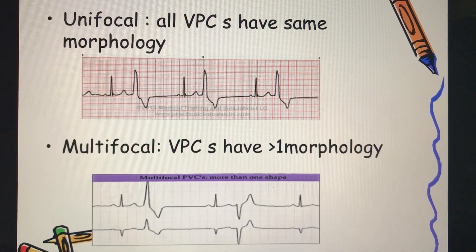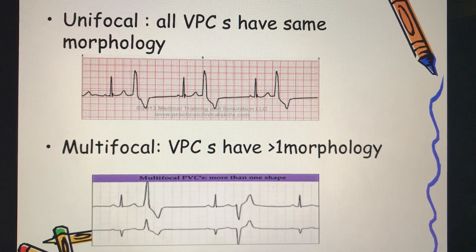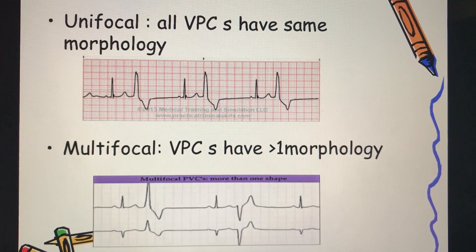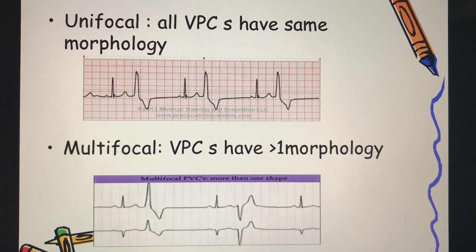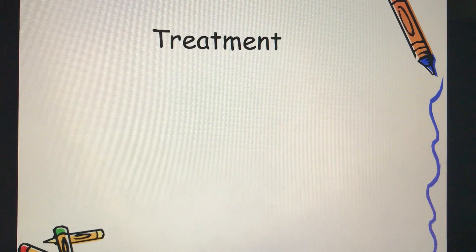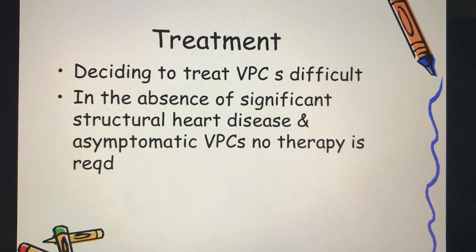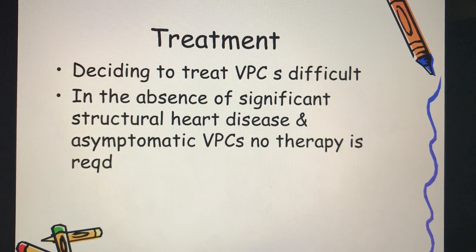VPCs can also be classified as unifocal or multifocal. Unifocal VPCs have the same morphology because they all originate from a common source or common focus. Multifocal VPCs have more than one morphology because they originate from more than one focus.